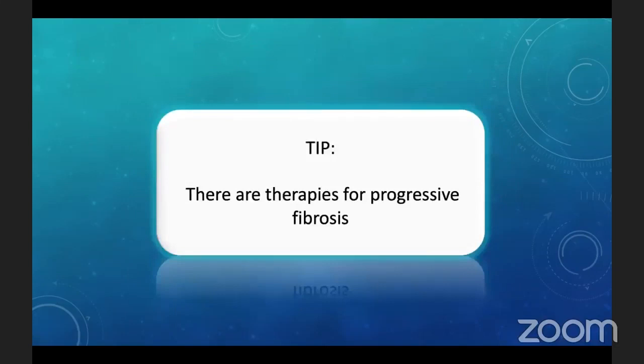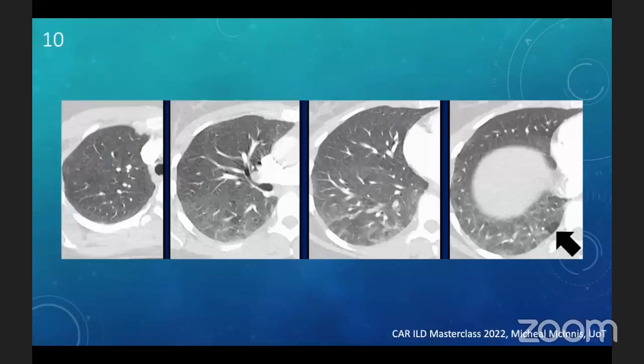It's really important to detect even if there is minimal fibrosis. Why? Because they will follow up the patient for any progression of fibrosis. And if the patient is rapidly progressing in terms of degrees of fibrosis, then they will initiate the antifibrotic medications for them. Previously, it was only for IPF, but currently they also give these medications for various fibrotic types of ILDs. I believe this is our last case, maybe.